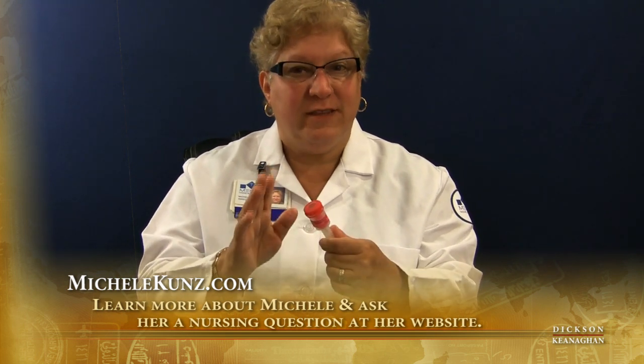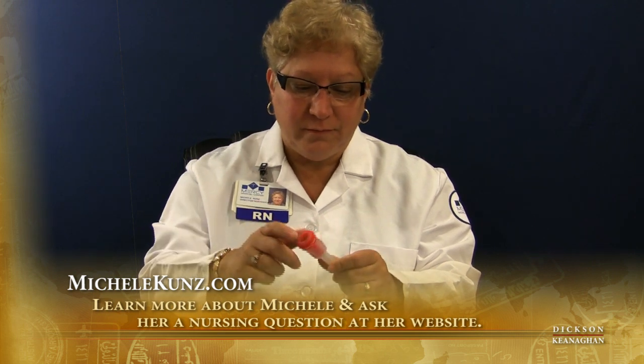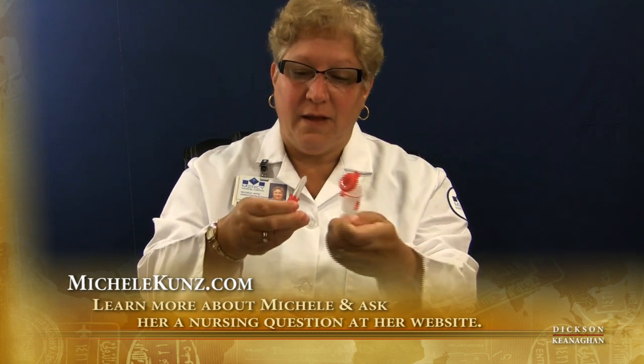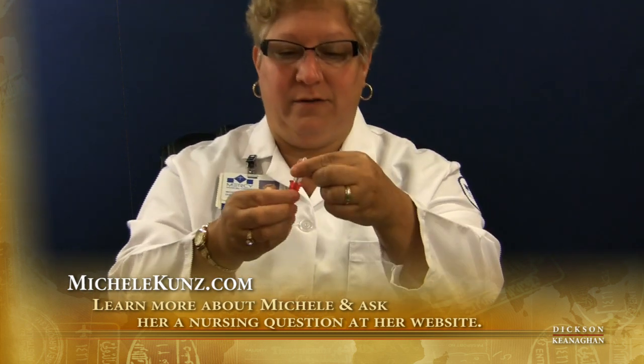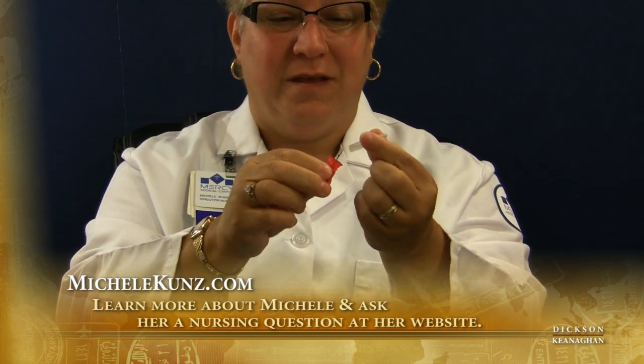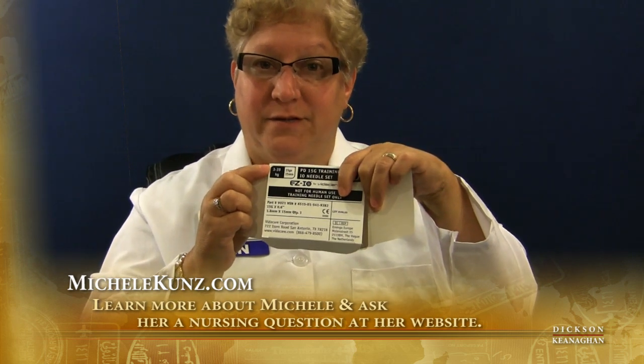In an emergency situation, this is a wonderful device and you'll see exactly what I mean. So this is a pediatric needle — you can see it comes with a sterile cover and it is very small. The pediatric needle is actually for three to 39 kilogram patients, so it's a good guideline right there on the box.